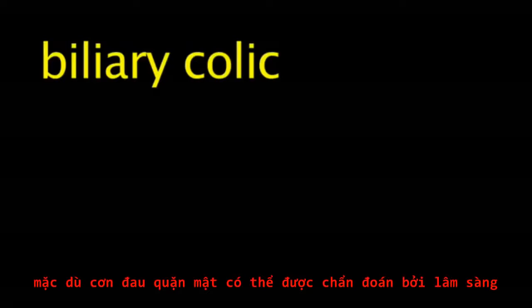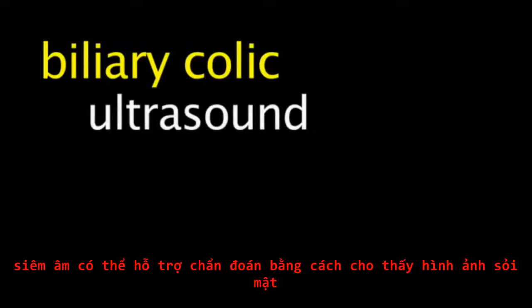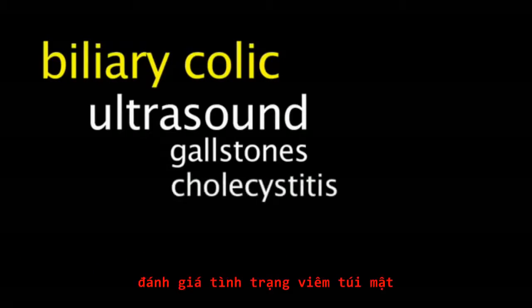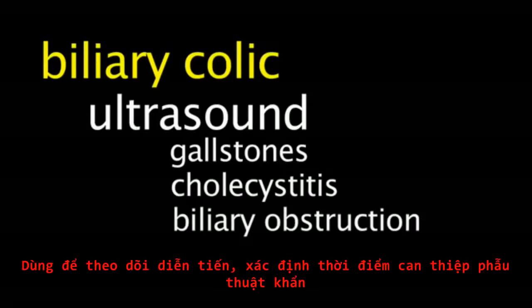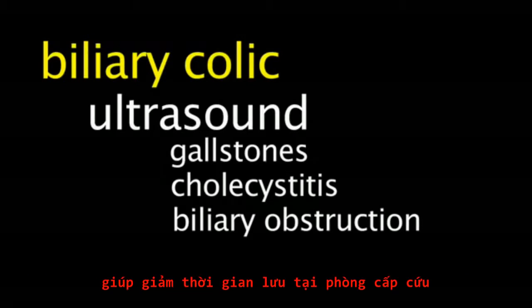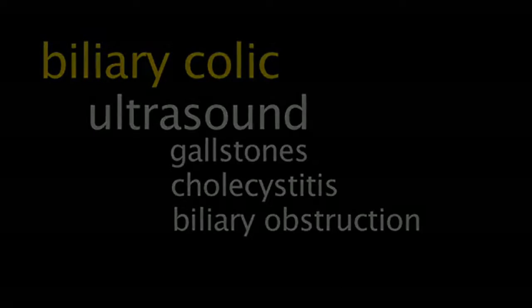Although biliary colic is primarily a clinical diagnosis, ultrasound can assist in the diagnosis by visualizing gallstones, evaluating for cholecystitis, and evaluating for biliary obstruction. This can be used to facilitate follow-up or determine if surgical consult is warranted immediately. It also decreases time in the emergency department.